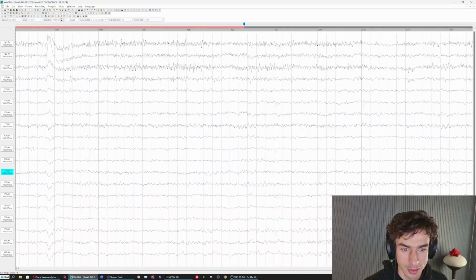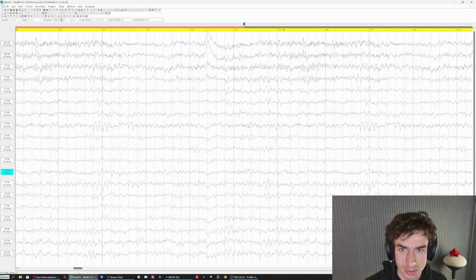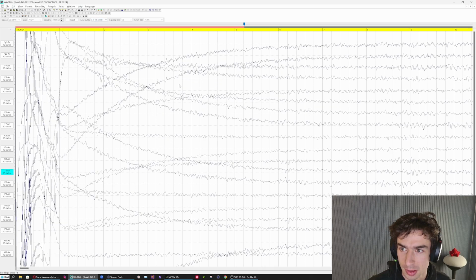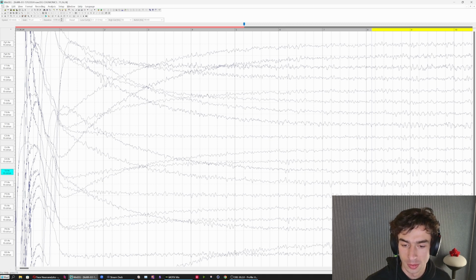So we'll start by cleaning this up with ICA. I'm going to right click in the top here to make the selection. And we're going to put in a little bit more of a low cut just to flatten out this beginning part. Actually, we're going to omit that from the ICA de-artifacting. Not a whole bunch of line noise, but we might as well put the notch filter in for what's appropriate for North America. So it's recorded in Alaska.